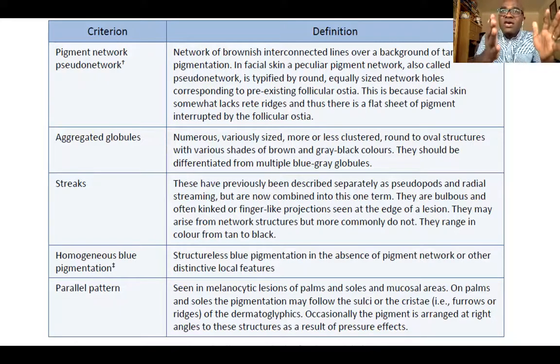So in the first step of a 2-step algorithm, if it fulfills these criteria, then your answer is yes, this is a melanocytic lesion.